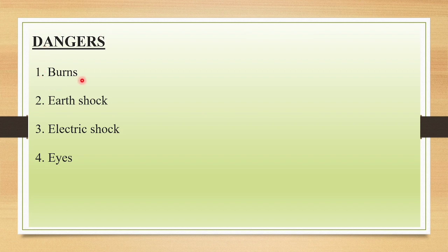If the patient does not tell you, they may have a chance of getting burns because of the excessive heat produced by the microwaves. Or suppose it's a contraindicated patient, for example an unreliable patient, and you accidentally give this microwave, they may also have a chance of getting burns. Or an unconscious patient, or even those who have decreased sensation can also have a chance of getting these burns.